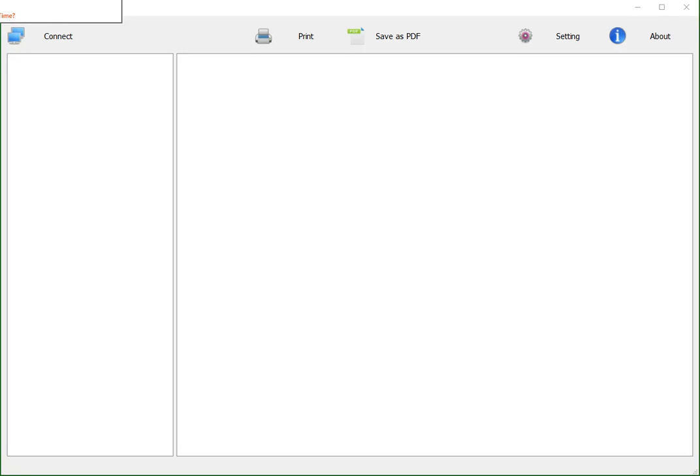Hello, today we will be going over the FL50 Vital Signs Monitor and how to connect it to the PC software to extract any recordings from the device for further review. With the device connected, please make sure to select the To PC mode in the Settings option.